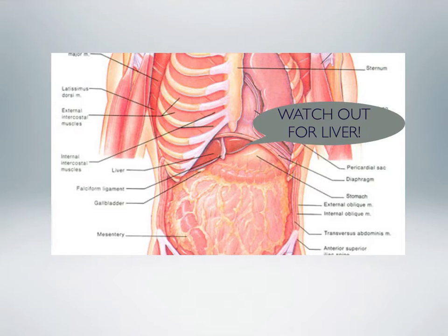So just looking at the anatomy here, you can see that if you go subxiphoid at a 45-degree angle, aiming towards the shoulder, one just about has to go through the liver. But you're using a fairly thin needle, and if you recall, a person who has a liver biopsy has a very large core of the liver removed, and there are usually no untoward side effects. The bleeding will typically stop.